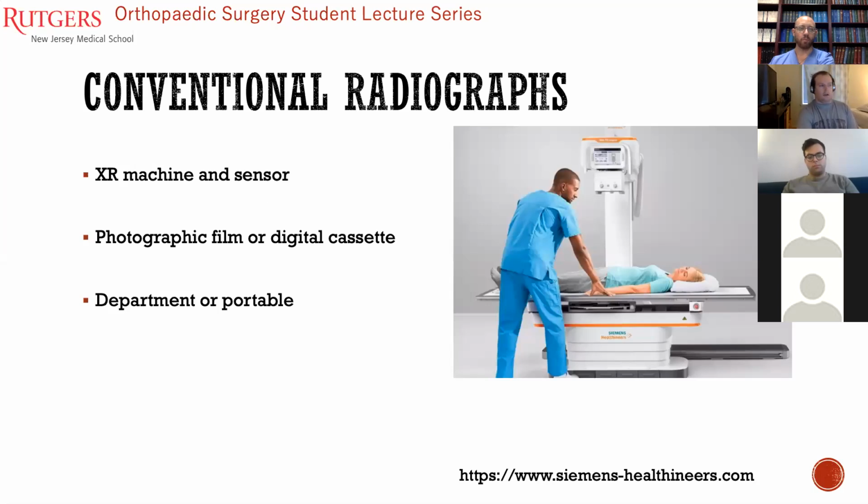So looking at conventional radiographs, these are what we normally think of as our first line screening tool. It uses an X-ray machine, which you can see at the top of the screen, followed by a sensor at the bottom. And the X-rays are emitted, pass through the body, and are picked up by a photographic film or a digital cassette underneath.